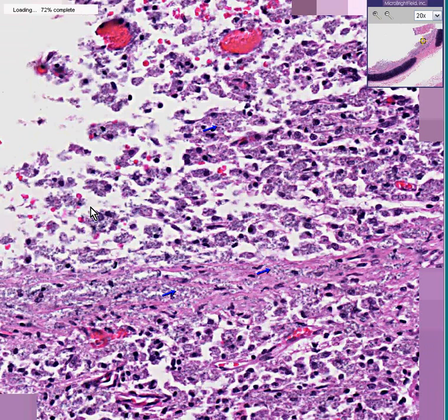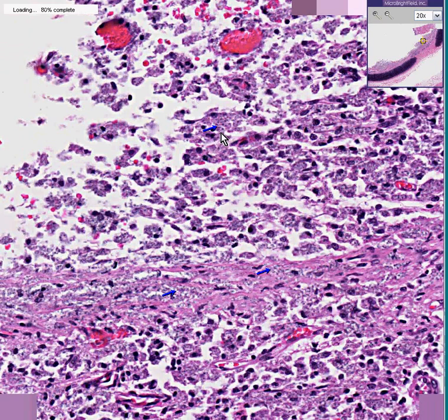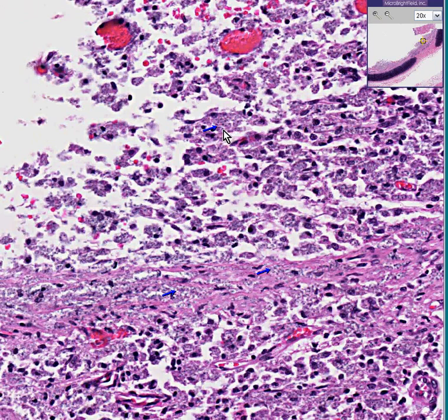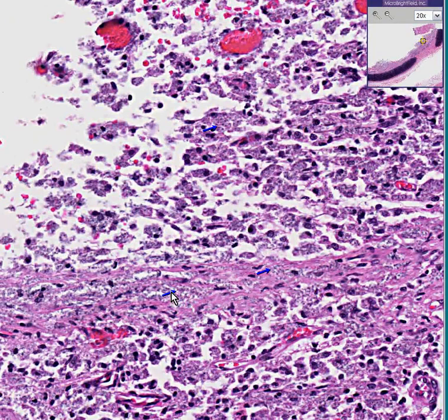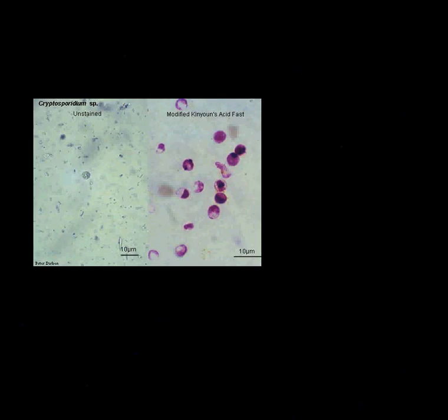Do you see these little guys here? They're almost like about half the size of a red blood cell — maybe five microns — here, and here, and here, and here, and actually all of these tiny little dots. This is cryptosporidium. At this power you're probably not impressed, but if you were to do a beautiful stain for cryptosporidium, you might see something like this.